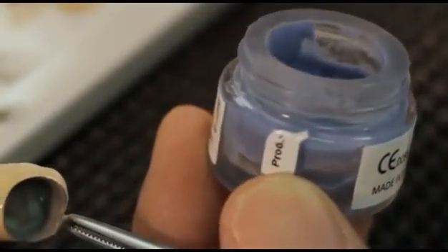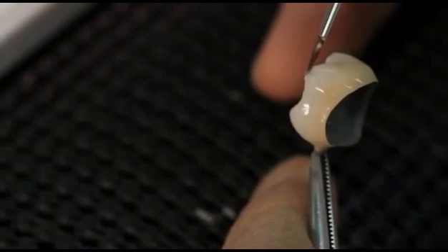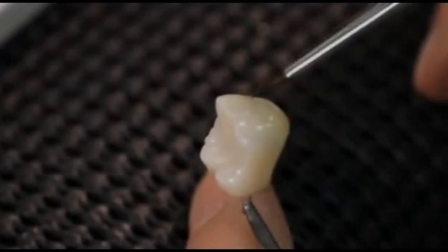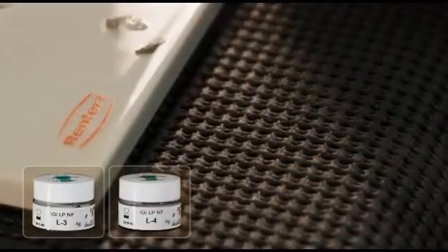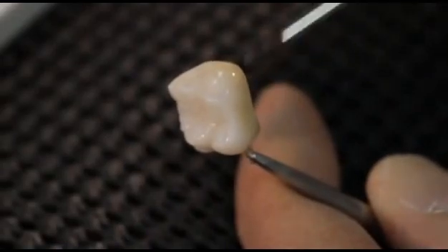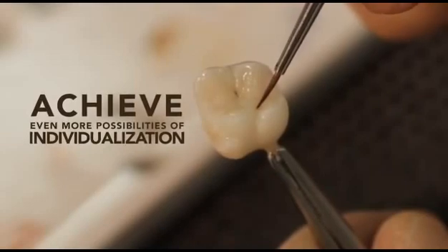Two bluish effect Lustre Paste NF — L5 light blue and L6 dark blue — provide a bluish opalescent appearance in the incisal area. Greenish effect Lustre Paste NF L8 olive, for a greenish effect, can be mixed with all Lustre Paste NF. To achieve even higher transparency, the two grayish effect Lustre Paste NF L3 or L4 can be used as well.